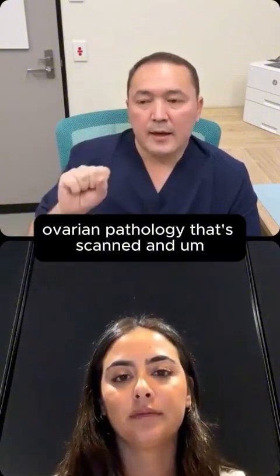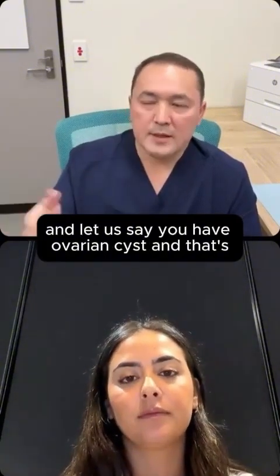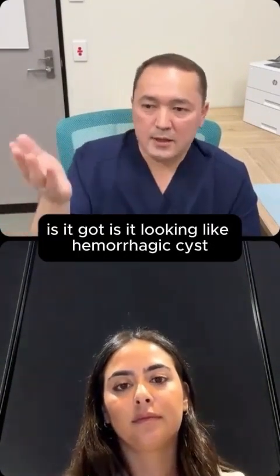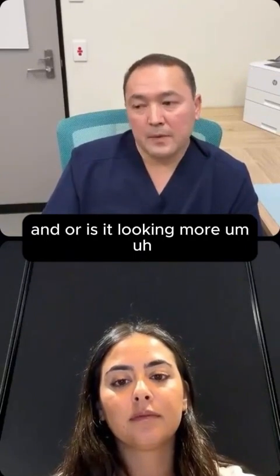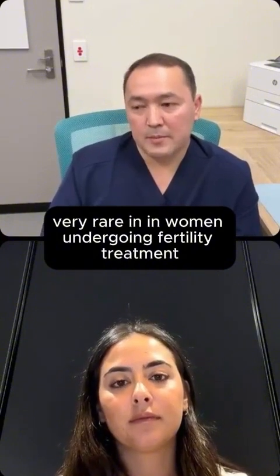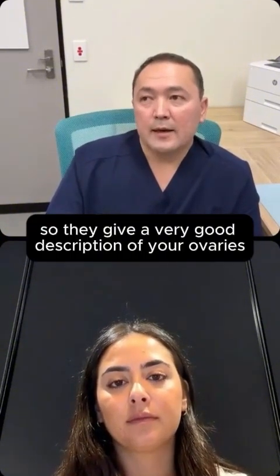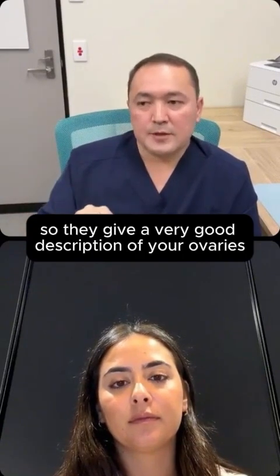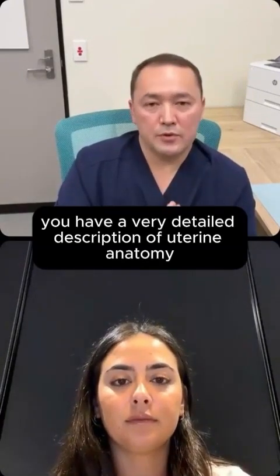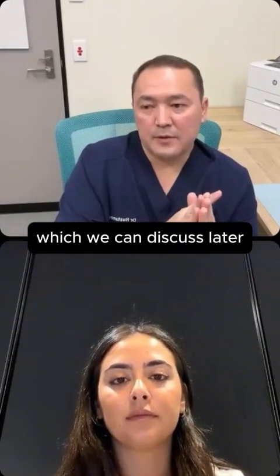If there's any uterine or ovarian pathology, that's scanned. And let us say you have an ovarian cyst, then they describe the nature of the cyst. Is it looking like a hemorrhagic cyst, endometriotic cyst, or dermoid cyst, or is it looking more like a sinister cyst, which is very, very rare in women undergoing fertility treatment, but it may happen. So they give a very good description of the ovaries, and also a very detailed description of uterine anatomy as a part of MUSA criteria, which we can discuss later.